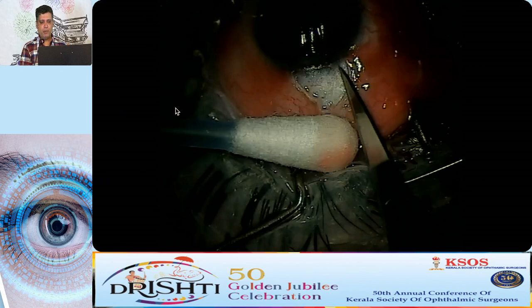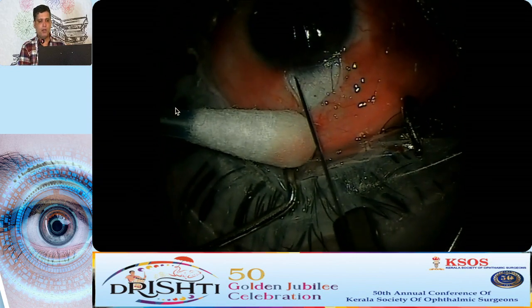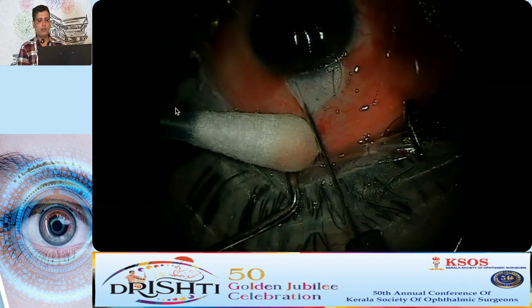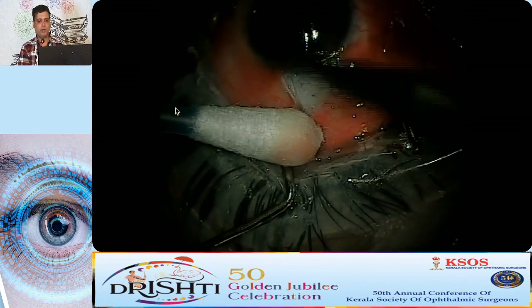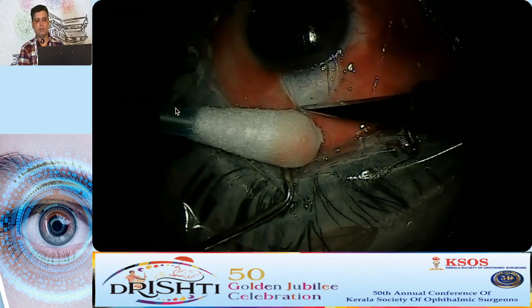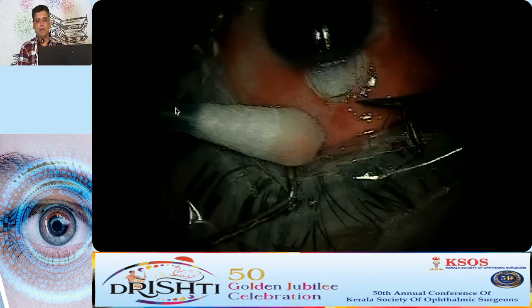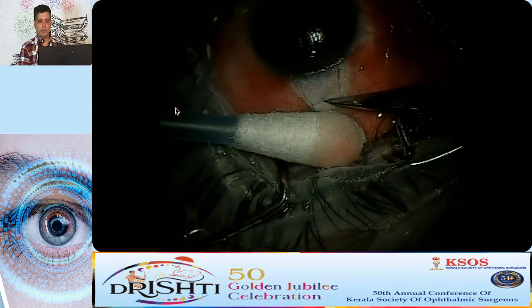Now, after applying minimal cautery, you start the dissection of the scleral flap. Again, various methods. If you are making side cuts, as you notice, I have started a little 1 millimeter posterior to the limbal area. You don't want a very anterior dissection because the aqueous can get filtered into those areas and can create blebs which dissect into the cornea subsequently.